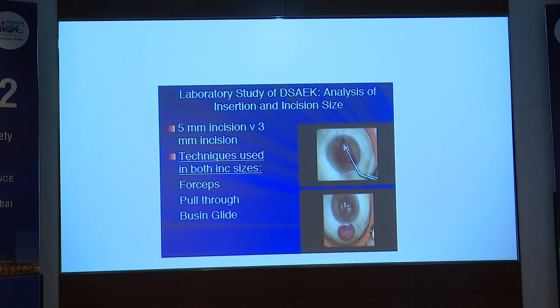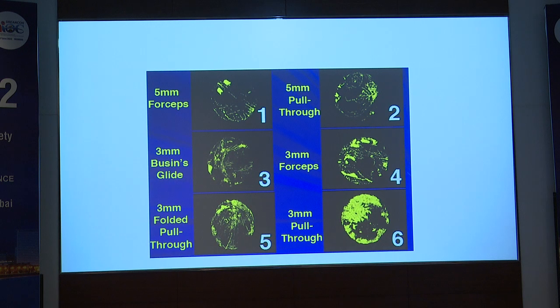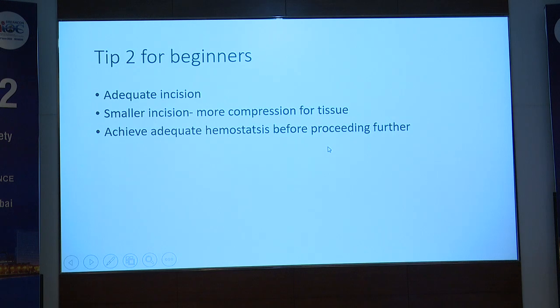Initially, people would prefer doing a taco fold, a 60-40 fold. However, it's seen that the endothelial cell loss while doing this fold is much higher compared to now using simpler techniques like your sheet glide or just pushing the tissue inside the anterior chamber by placing it on a cohesive viscoelastic. So a simpler technique like using a 5mm incision, and you can usually just pull it through. You see that the endothelial cell loss is much lower in those cases.